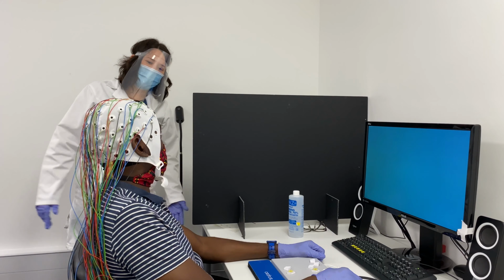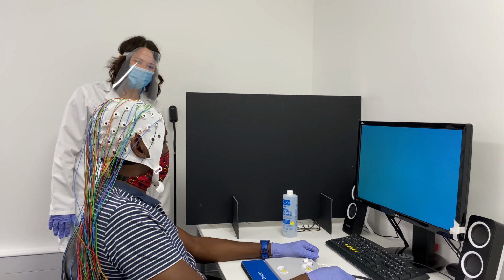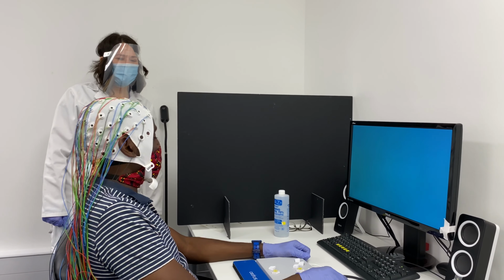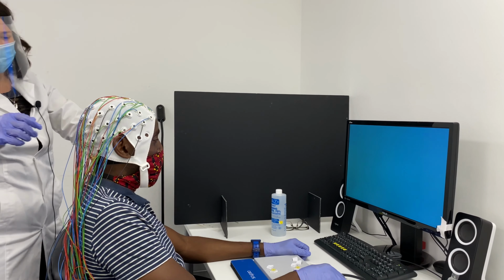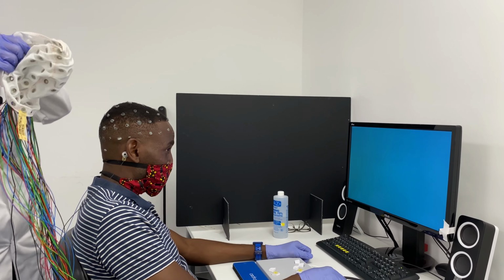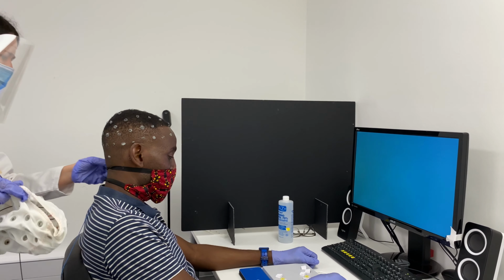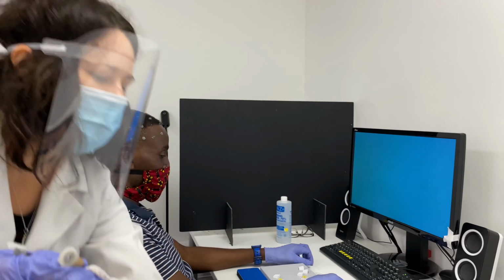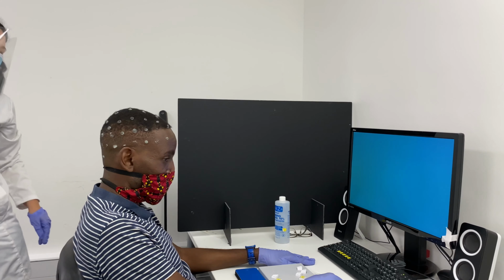Thank you so much, Andrew. We are done. So you did several experiments, the auditory one, the visual one, and even the resting state. And I guess now you want me to remove the cap as quickly as possible, and then you can wash your hair. Great. Okay, let's go to the washing room.